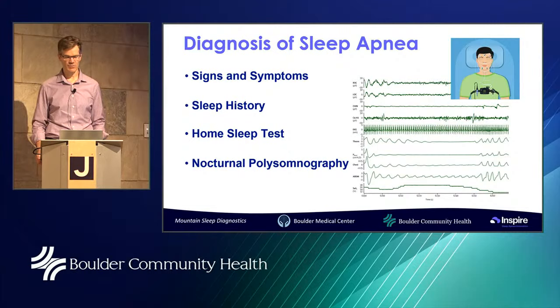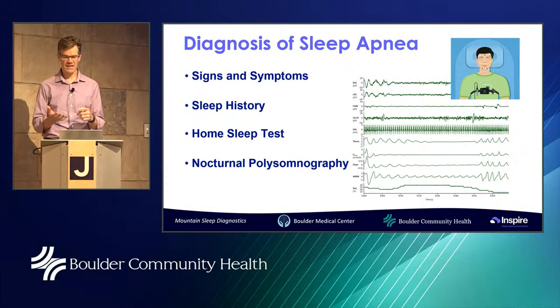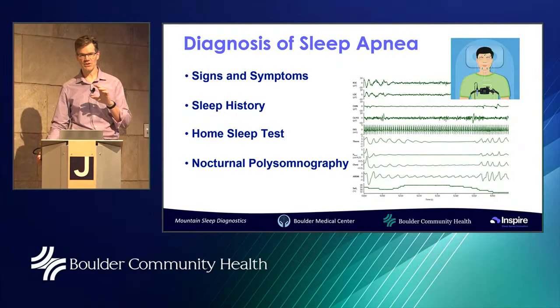The other advantage, in addition to the fact that we're able to get more accurate data, is that by having all these monitors, we can determine whether you're asleep. The home sleep tests, most of them don't even try to do that. A few of them do, and they're probably fairly good, but they're not as good as an in-lab sleep study, because we can actually measure whether or not you're asleep and get an accurate representation of your sleep.